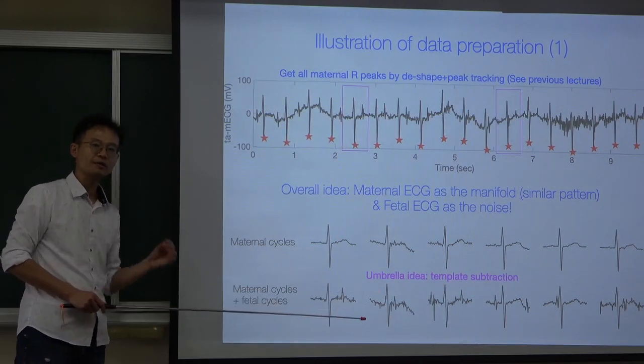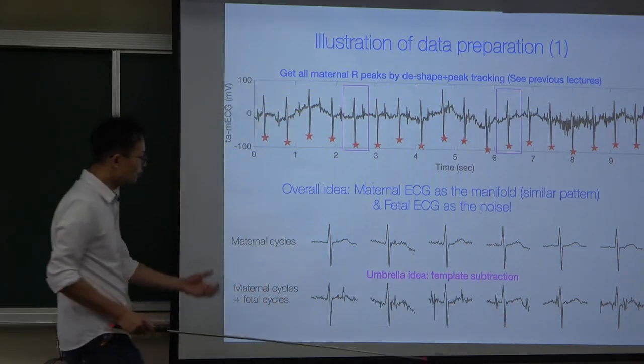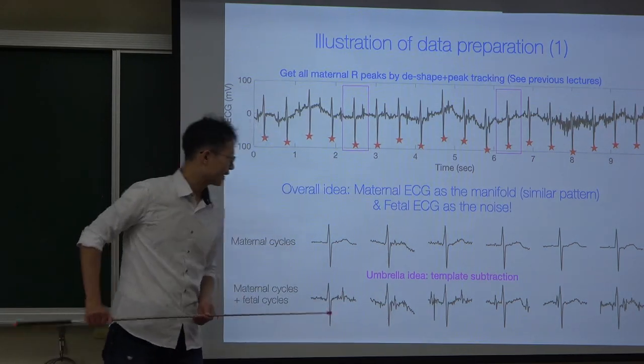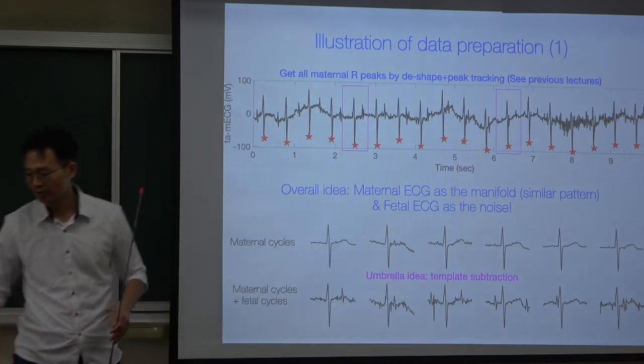So we want to try to recover this pattern so that we can recover the maternal ECG and get to the fetal ECG. So that is overall the template subtraction idea.